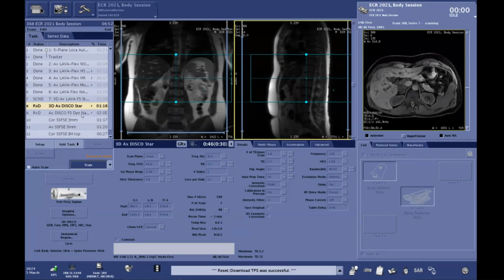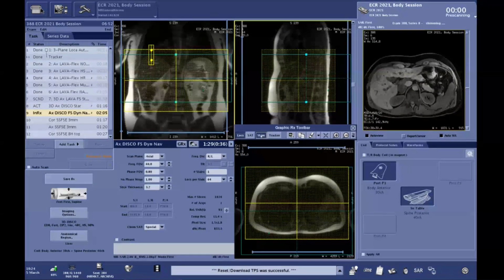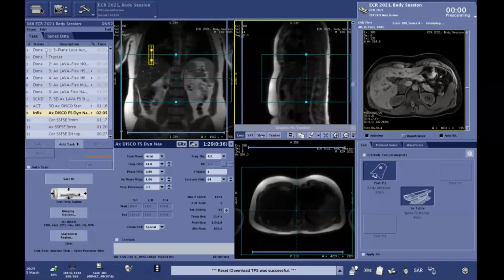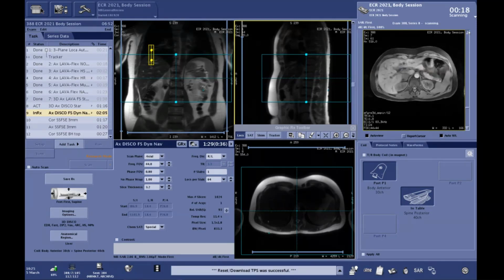And I want here to compare this technique to another free breathing dynamic acquisition, now using the navigator, the technique we saw just before. It was really to highlight that the way to deal with the breathing pattern of your patient is the key to the success of your examination. We really decided to have a large portfolio of solutions that could give you the possibility to adapt the way you are working to any type of patient.